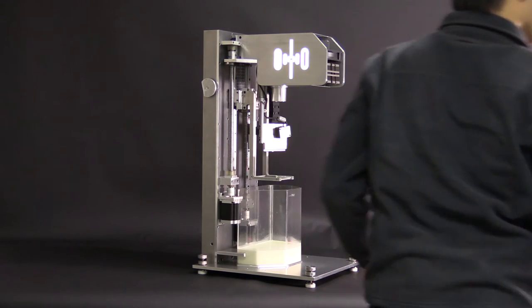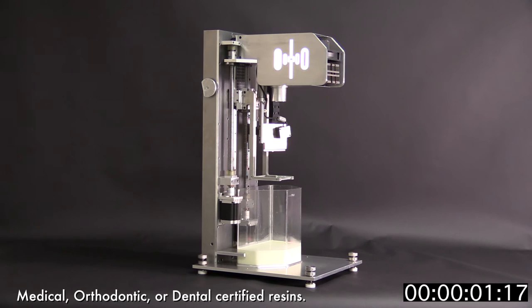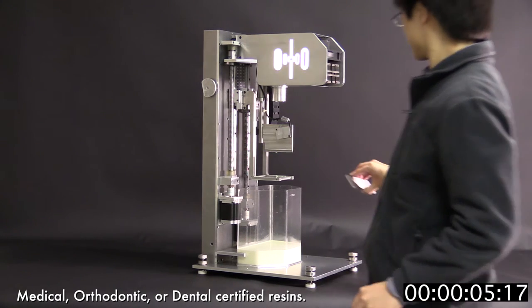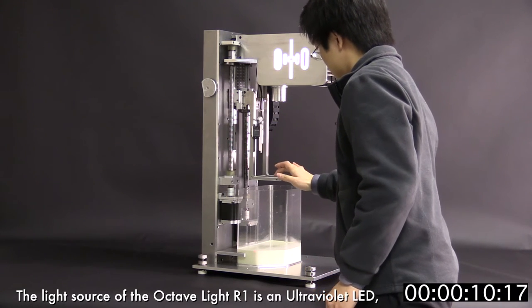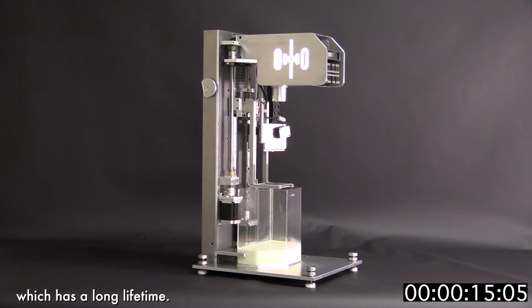The Octav Light R1 is compatible with most existing stereolithography 3D printing resins out there. You can print with your own medical, orthodontic, or dental certified resin. The light source of the Octav Light R1 is an ultraviolet LED, which has a long lifetime.